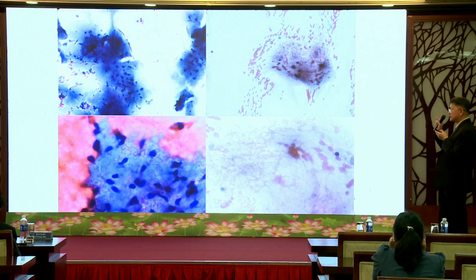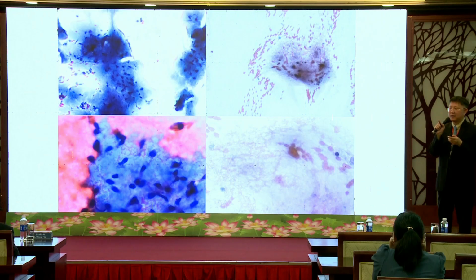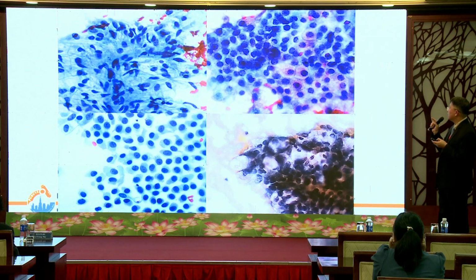In this case there is only the myxoid material, and I think the mucoid looks fainter compared to the myxoid. But the key point is that they contain no cells. Look at the cell morphology.